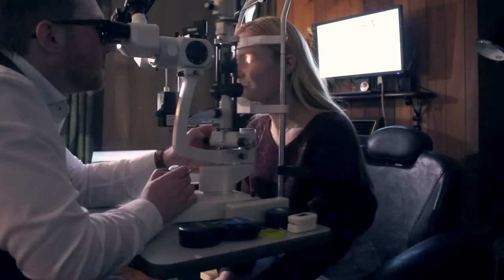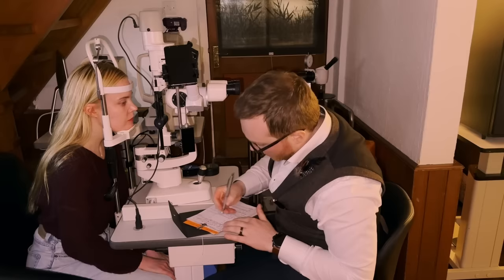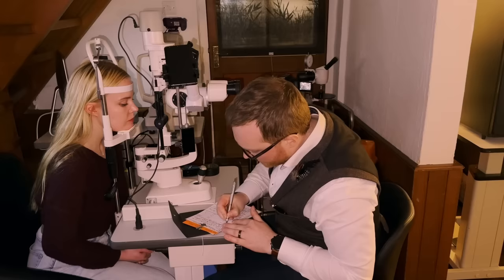So what I'm doing there is just looking at how well the tear film lasts over the surface of your eyes. Particularly if we're doing a lot of screen work, sometimes we can get dry eye. So I'm just going to make a few quick notes about the front of your eyes. And then we'll have a look at the rear surface of your eye.